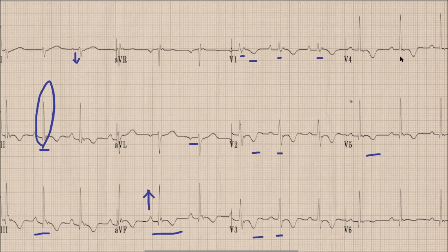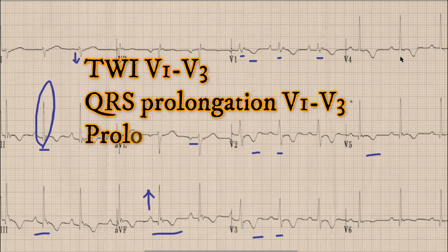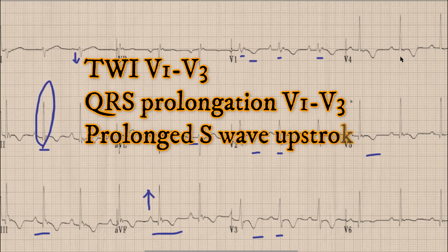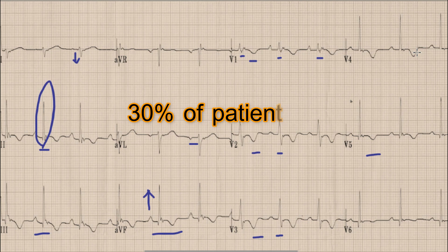The main ECG findings in a patient with ARVC include T wave inversions in anterior chest leads V1, V2, and V3. There is localized prolongation of the QRS complex in leads V1, V2, and V3 with a duration of around 110 ms. Also in these leads there is prolonged upstroke of the S wave which is more than 55 ms. The most specific sign of ARVC on an ECG is an epsilon wave, which is present in about 30% of patients.